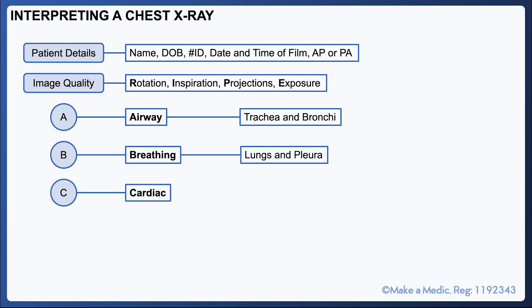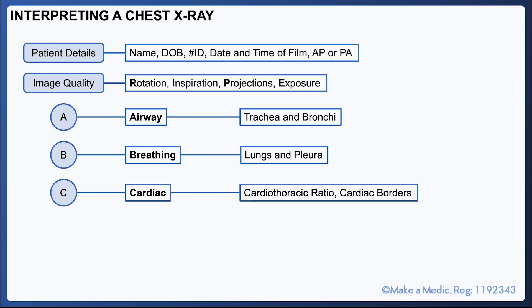Moving on to C, you take a look at the appearance of the heart. You want to make note of the cardiothoracic ratio, which is the ratio of the width of the heart compared to the width of the thorax. A raised cardiothoracic ratio is often seen in patients with heart failure. It's important to also trace the heart borders because obscuring of the heart borders may be suggestive of retrocardiac masses or consolidation.